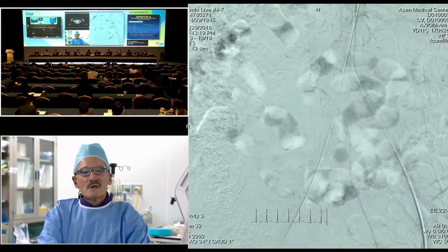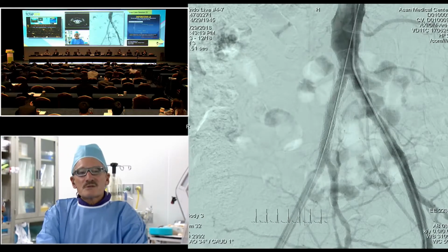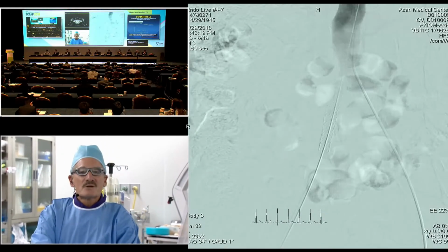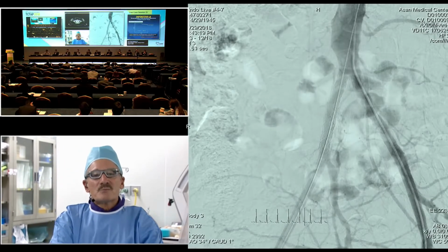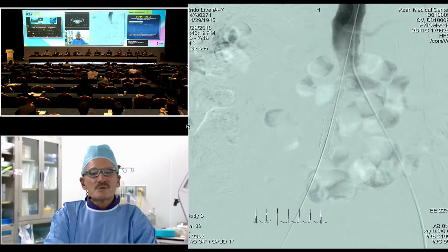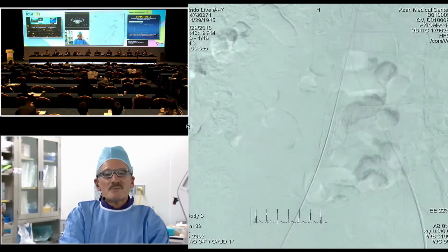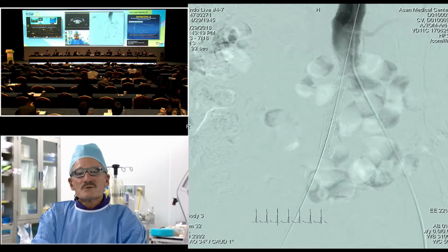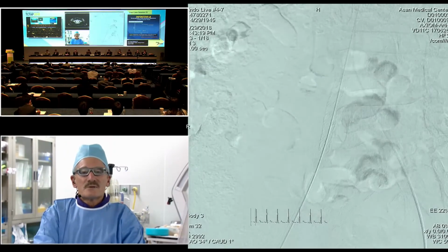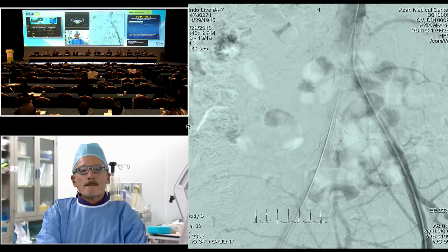But they all work well. The difference is that the VBX is designed to be flexible. The stent rings are not connected, so it's inherently more flexible. Both it and the LifeStream are balloon expandable, with similar expansion ratios and profiles. There are minor differences here and there, but the main difference between the 2 is that the VBX is clearly the most flexible, inherent in its design.